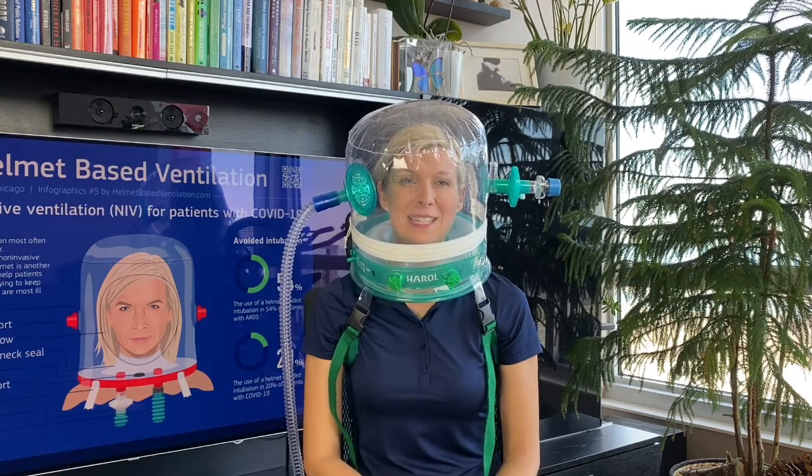Thank you to the company Harol for making this helmet. I hope to see it used to save patients from intubation and help them recover faster. Thank you.